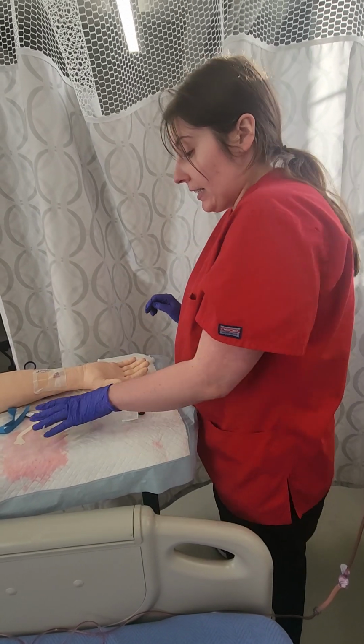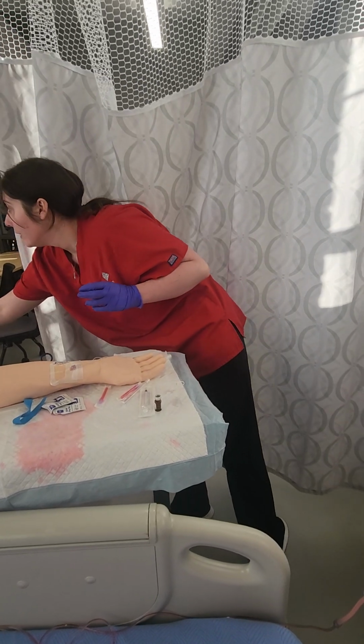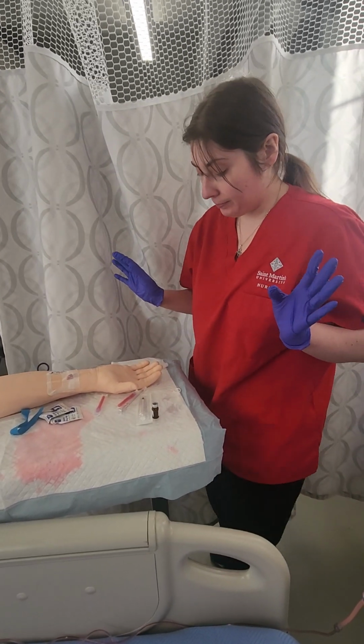And I can let that set while I get my drug ready.